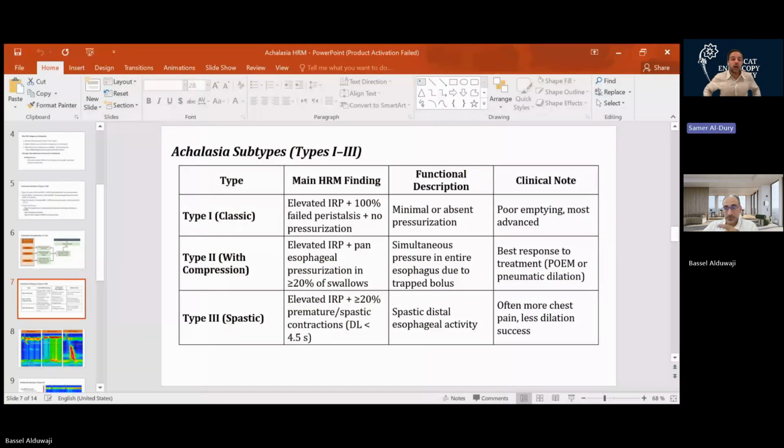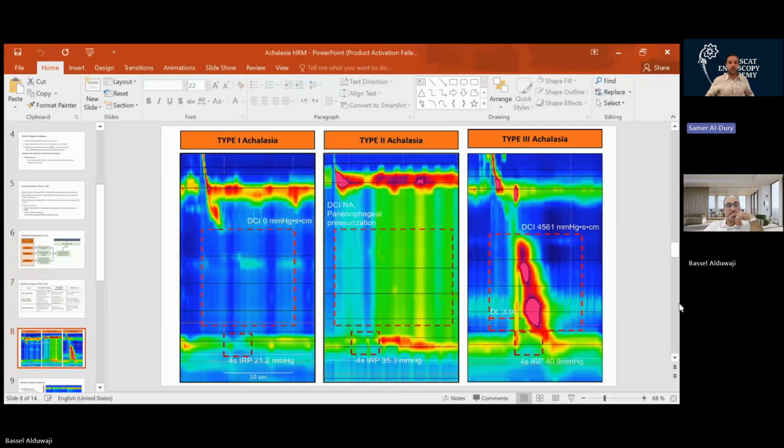So now, a little bit. Let's go and look at some photos here and see what it looks like in real life. Exactly. So now this is what we will see here.